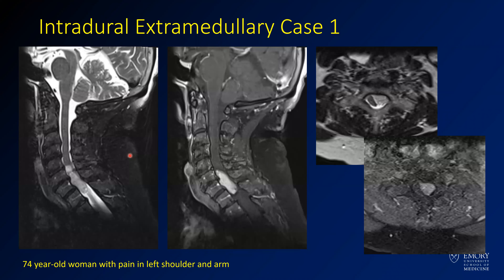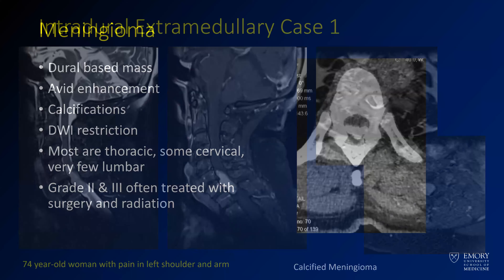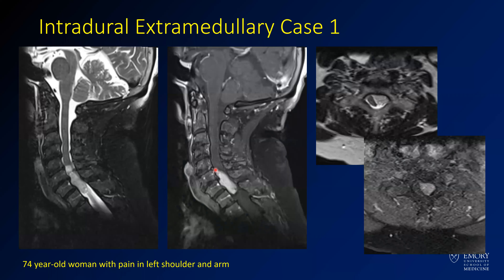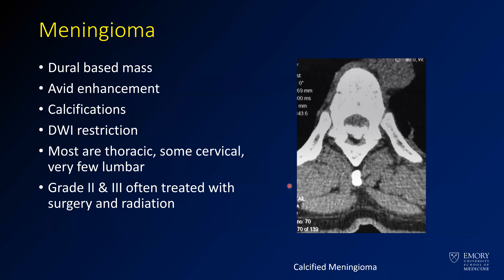This is a 74-year-old woman with an intradural extramedullary lesion and similar degree of enhancement with an enhancing nodule. On the axials, the cord is actually pushed off to the side, deviated by the mass. This woman was having pain in her left shoulder and arm. This was a meningioma — you can see a little dural tail, and they can really mimic schwannomas. If you see a calcified lesion within the spinal canal, definitely think about meningioma. If you saw this within the brain, you'd be almost certain it was a meningioma. They're treated the same as brain meningiomas: surgery, with radiation for grades 2 and 3.